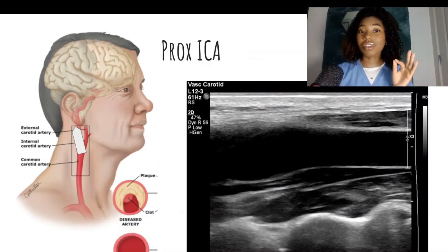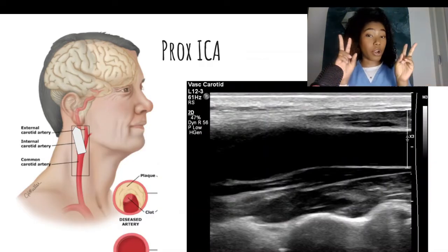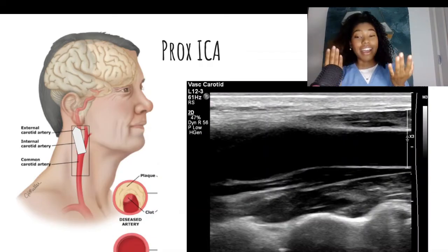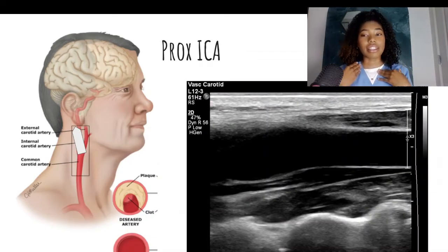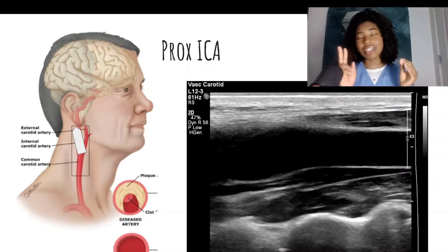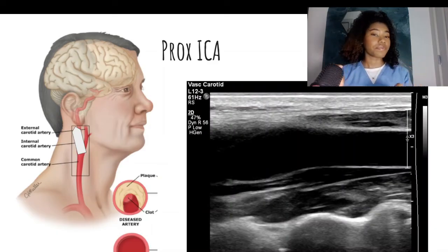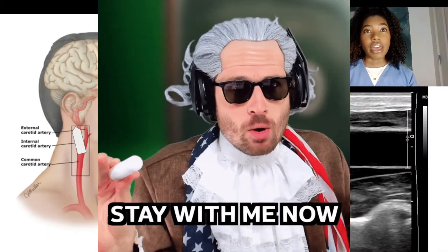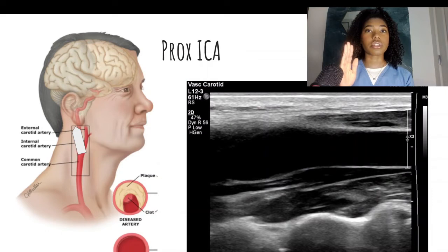Next, we are going to look at the proximal internal carotid artery. The patient is myself — I scanned myself for these images, and I wanted to make sure this video had good quality for you. Your transducer should be angled slightly towards the back of the patient's neck. The ICA will typically be larger and will not have any branches coming off of it. You want to make sure that you're not on the ECA, but on the ICA.